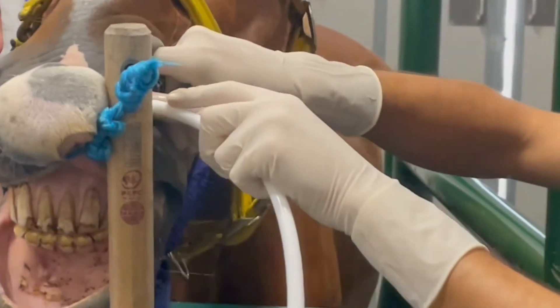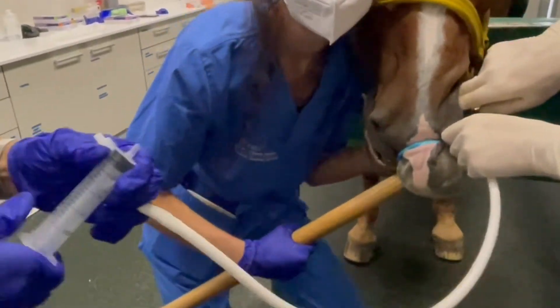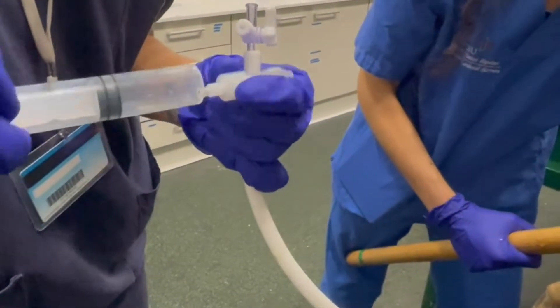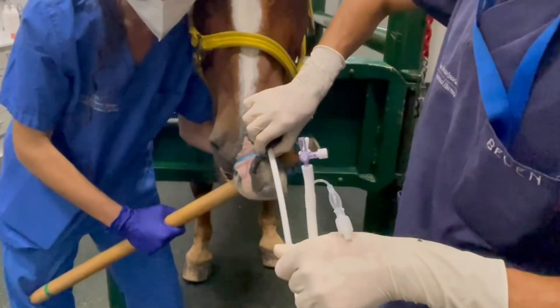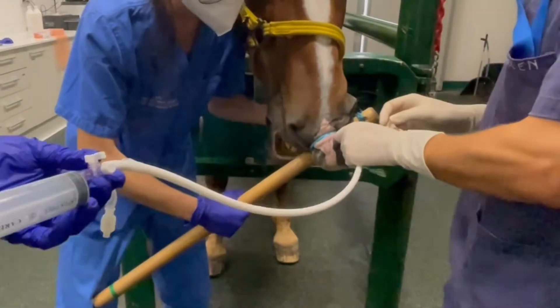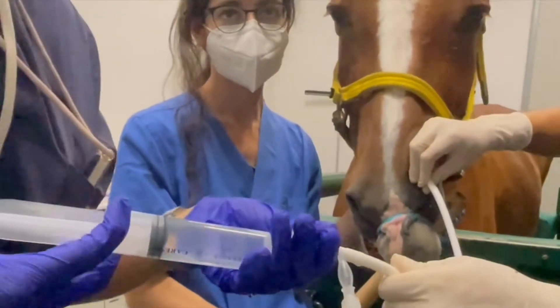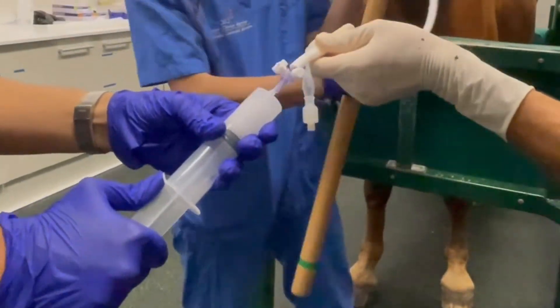Once the catheter has reached a small bronchus and cannot advance anymore, the balloon on the catheter tip is inflated with 10 ml of air to provide a seal within the airway lumen. The entire volume of lavage solution is then infused into the lung via the catheter, followed by immediate aspiration using the 60 ml syringes.